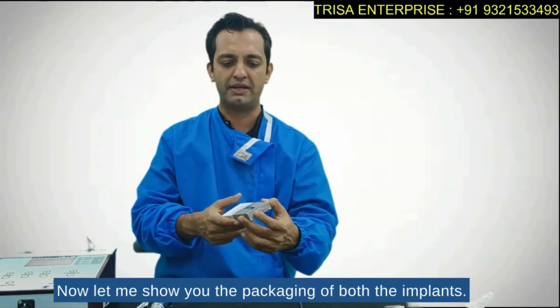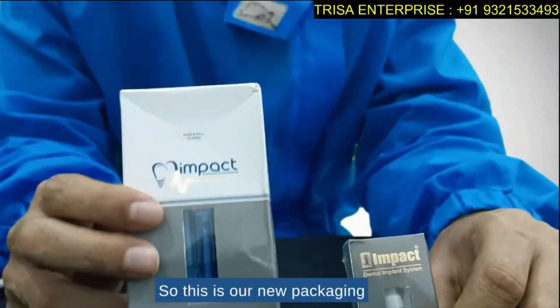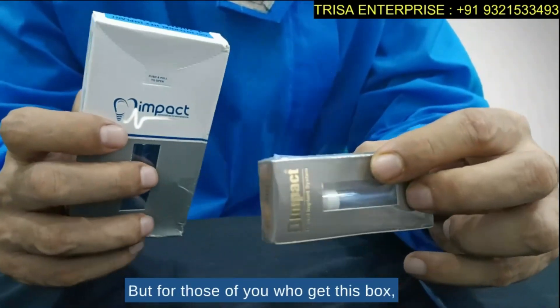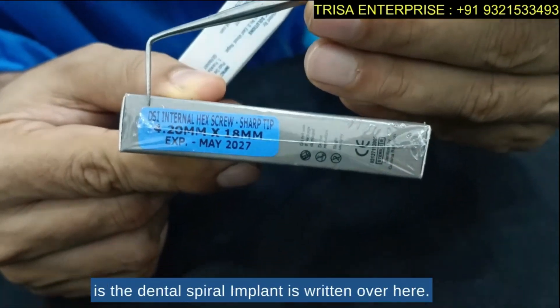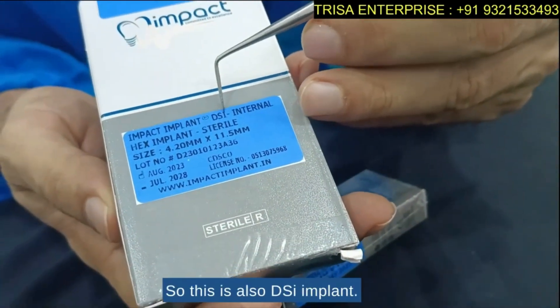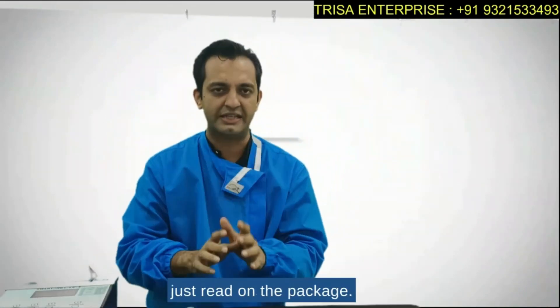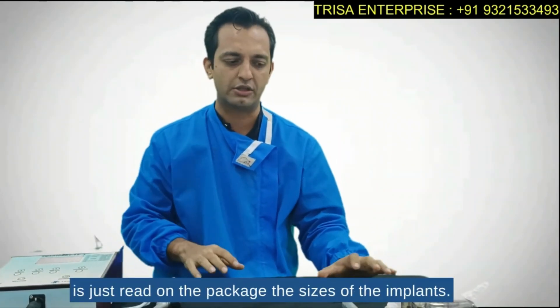Now let me show you the packaging of both implants. You may find them in either of these packages — this is the new packaging and this is the old packaging. All future deliveries will be in the new packaging, but if you get the old box, just read the label: the DSI (Dental Spiral Implant) is written there. Don't worry about the packaging — just read the package to identify the implant.